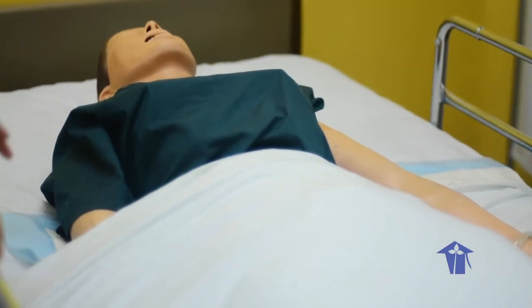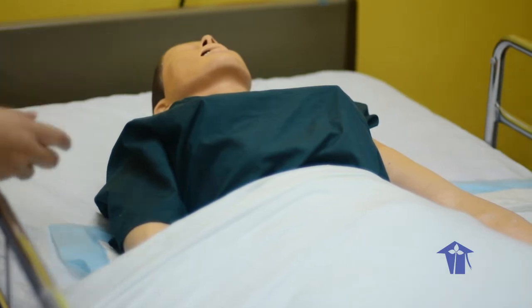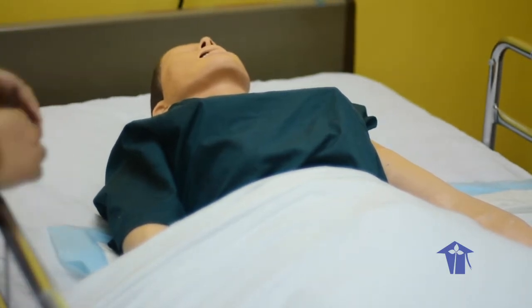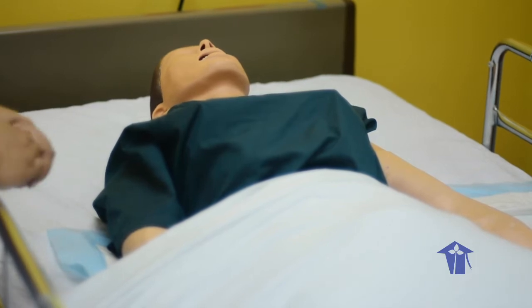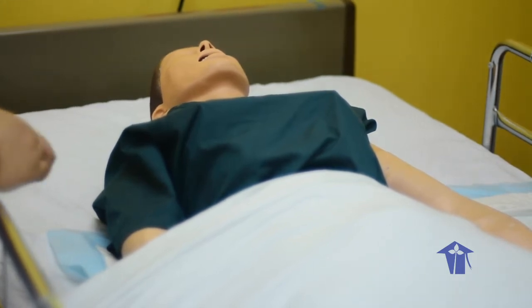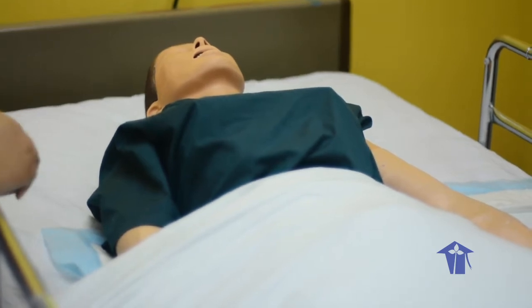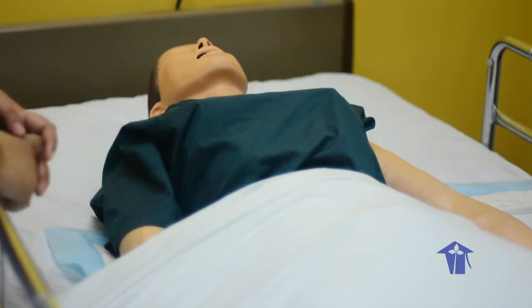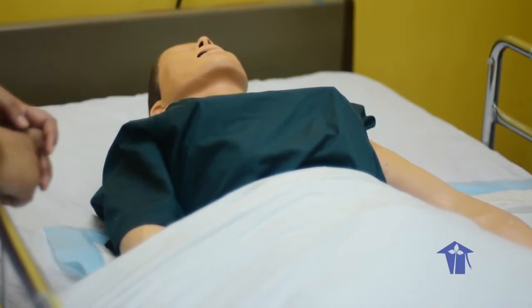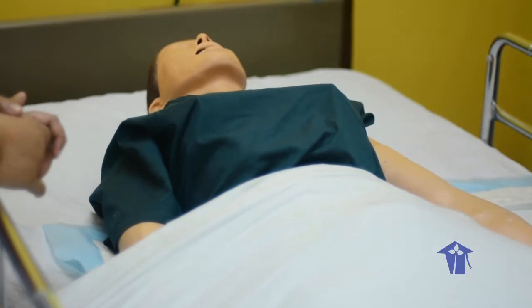So first we are going to obviously introduce ourselves and get permission from our patient. So hi, good morning. Could you tell me your name? Jane Smith. Hi Jane, my name is Miss Mohes, and today we are going to change your sheets, okay? Is that all right with you? That's fine. Great. Did you have a good night? Yeah, quiet. Are you in any pain at present? No pain. You sure no pain? 0 being no pain, 10 being the most. Any sort of pain? 0.